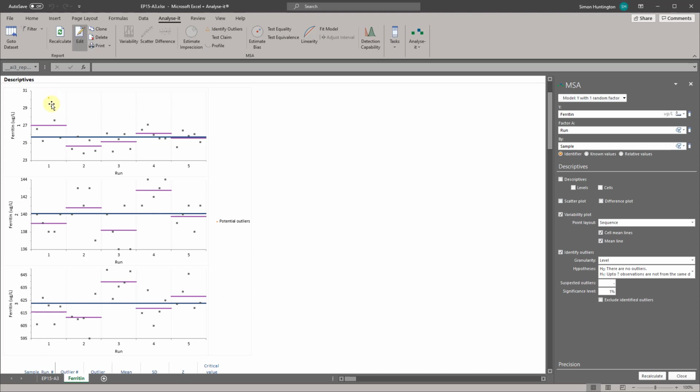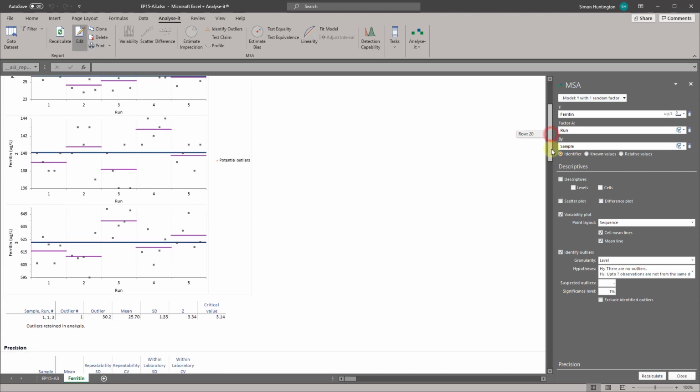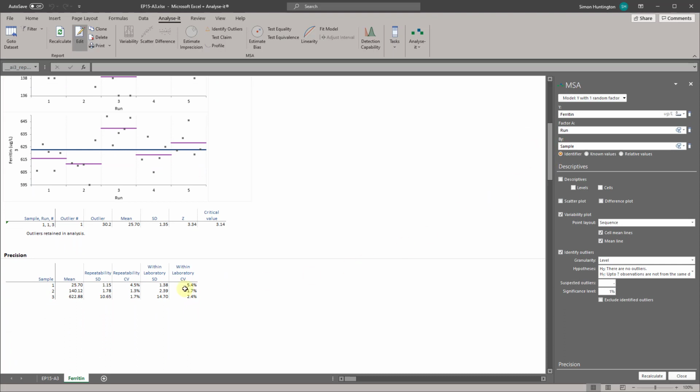If the data appears to be unusable, stop the evaluation and begin an expanded evaluation of the sources of measurement error, or contact the manufacturer. We note that one observation in sample 1, run 1, is highlighted in red as a potential outlier, but we do not know the reason for the aberrant result. We will continue with this observation included in the analysis and return to it later in the tutorial. The abbreviated variance components table shows precision expressed numerically as the standard deviation, SD, and coefficient of variation, CV.